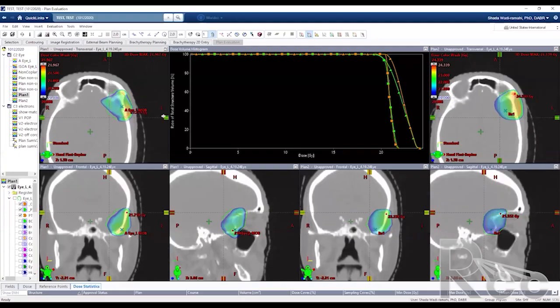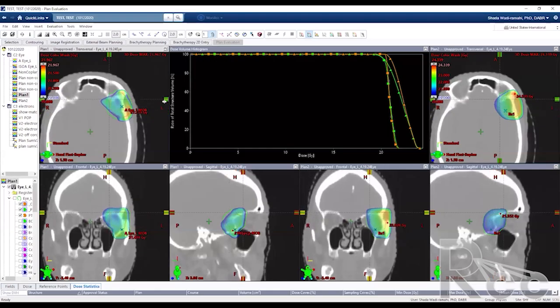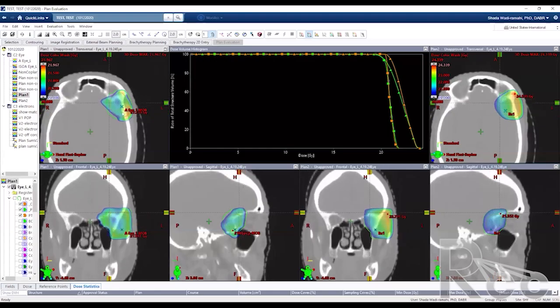Another thing to point out is something you don't see in the DVH at all. That is how much of your isodose line is going into the normal tissue. And this is normal brain tissue, right? So looking at plan number 1, all these isodose lines, as I said, blue is prescription, and as you go light blue and green, we're going higher and higher in dose.